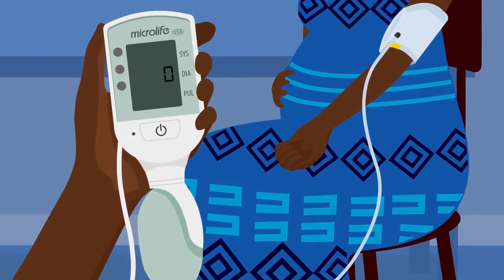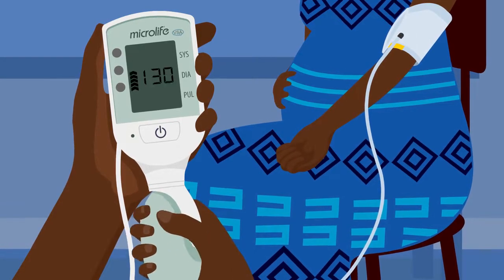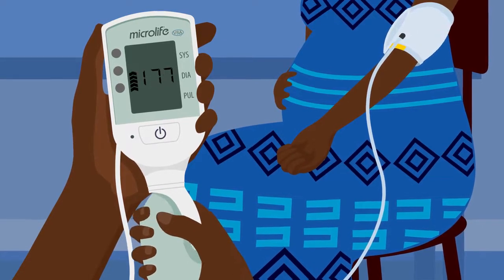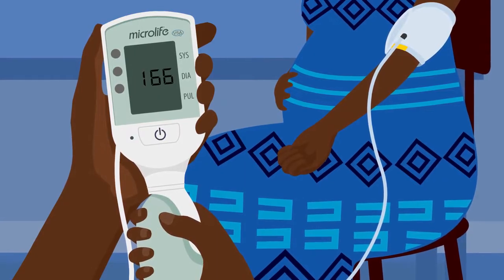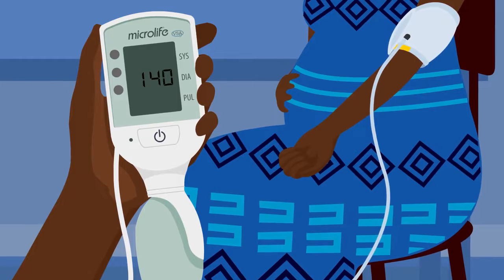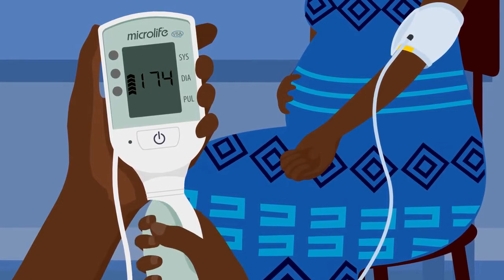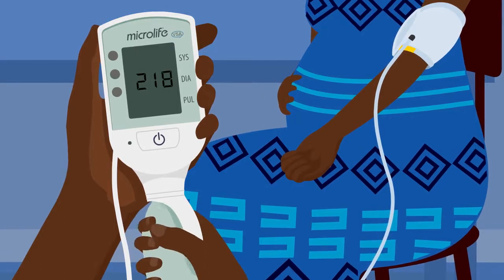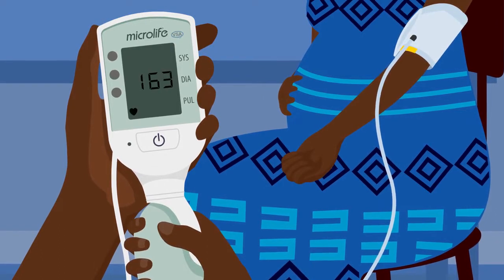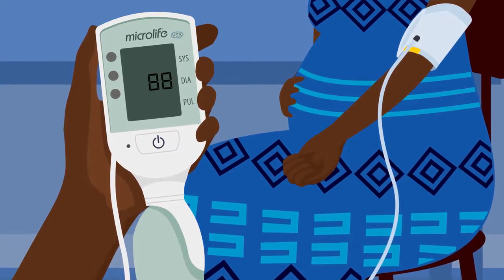Make sure the woman sits still and quiet. Begin pumping. Stop when you hear another beep noise — this will be at a number above 180. If the rising pointers appear again, pump the cuff until they disappear. The cuff will deflate on its own. Wait until the blood pressure and heart rate are shown on the screen.